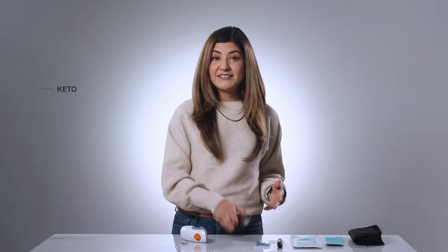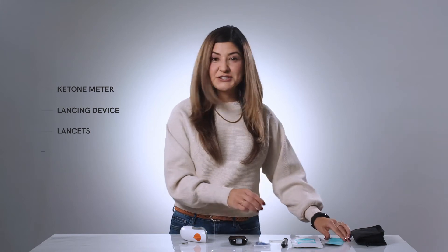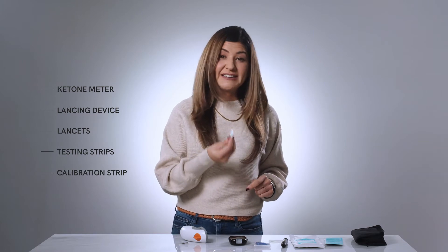The ketone meter comes in a zip pouch that holds the ketone meter, the lancing device, lancets, testing strips, and one calibration strip. This is all included in each batch of the ketone strips. When it's time to set up the ketone meter with your coach, you'll also want to have two AAA batteries, which you can go ahead and place in the meter now if you would like, or just before the call.